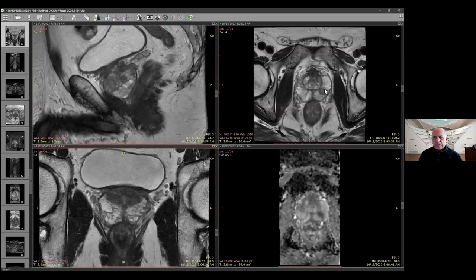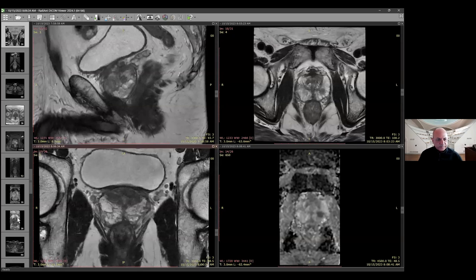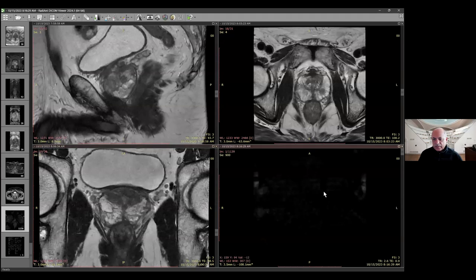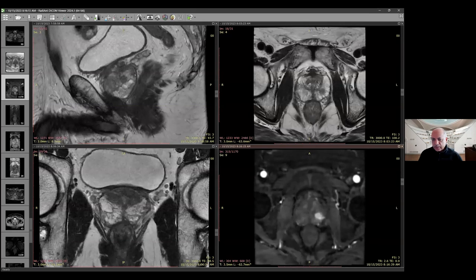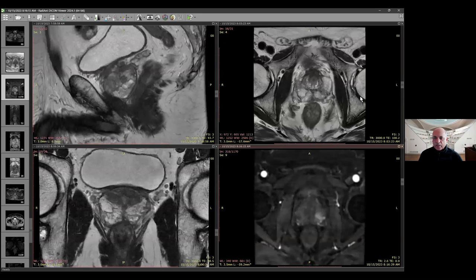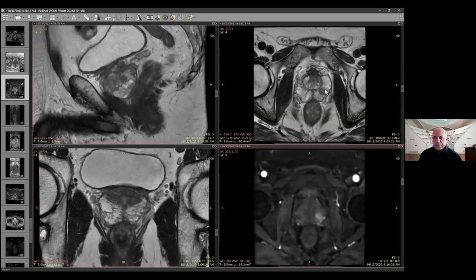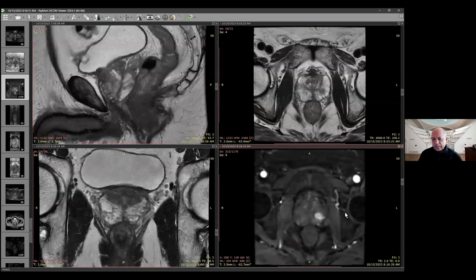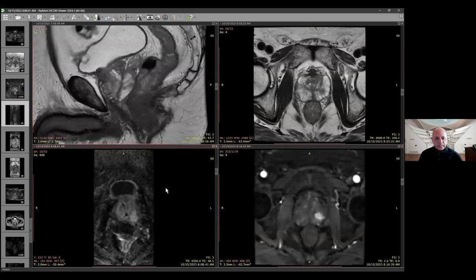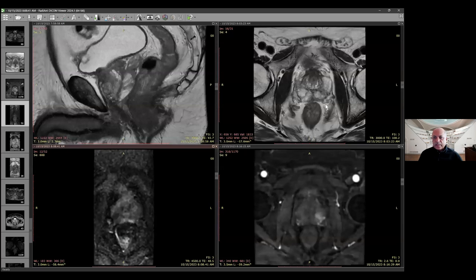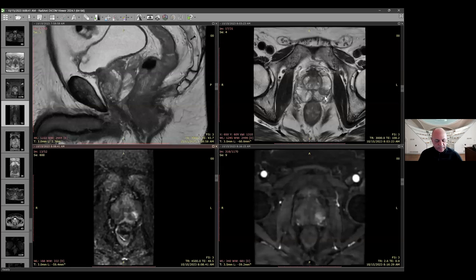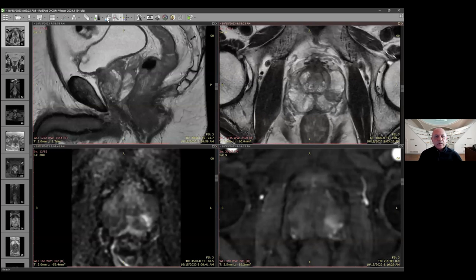As we scroll through, there is an ill-defined area in the left mid posterior peripheral zone, which is clearly dark on the ADC. Looking at the gadolinium-enhanced images, you can see there clearly is early enhancement in that lesion. The question now is: it's localized, the margins are ill-defined, you can see it's showing all the classic features — restricted diffusion, T2 dark signal, showing early enhancement — and it doesn't look like the capsule is being breached significantly.